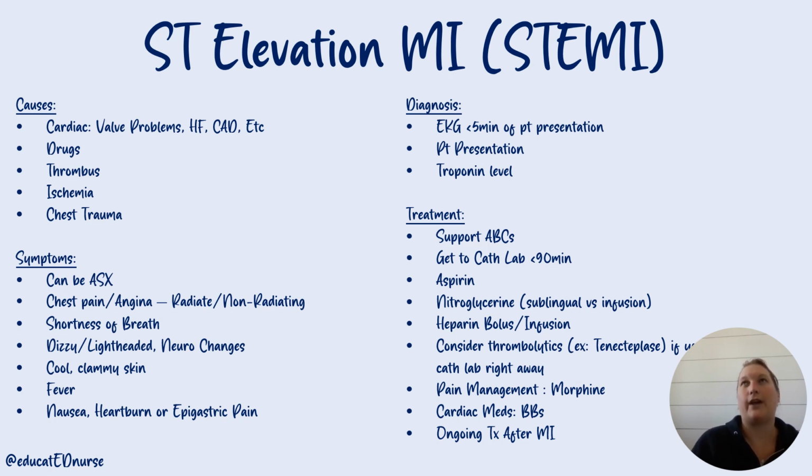I would say if you have any concerns about whether this person might have a cardiac-related cause for their chest pain, or if something's just not adding up, or they passed out, or they're having weird cardiac symptoms, or your spidey sense goes off, and you're unsure, just do an EKG, right? It's quick and easy. If a patient comes in to your place of business, the ER or clinic, complaining of chest pain, you really should do an EKG within 5 minutes of that patient's presentation.